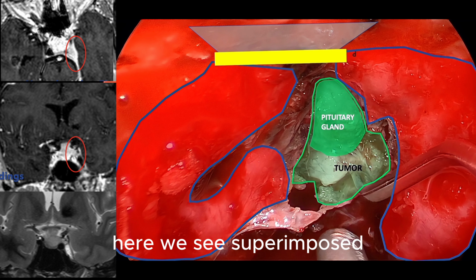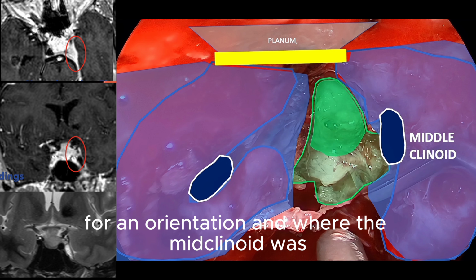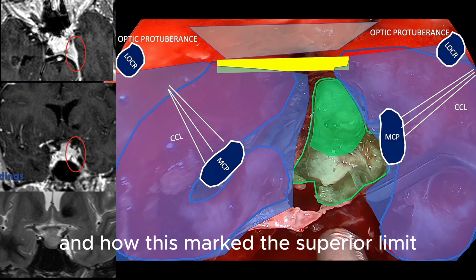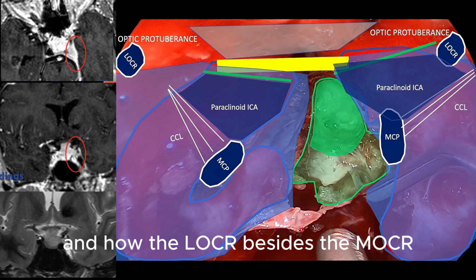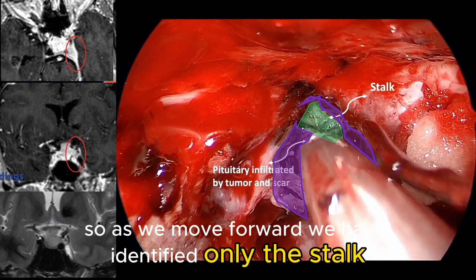Here we see in the exposure the drawings of the internal carotid artery and the cavernous sinus and the tuberculum sellae for orientation, and where the mid clinoid was before we removed it, and how this marked the superior limit of the cavernous sinus. And here we have the LOCR, and how the LOCR, besides the MOCR, marks the limits of the paraclinoid ICA. So as we move forward, we have identified only the stalk.